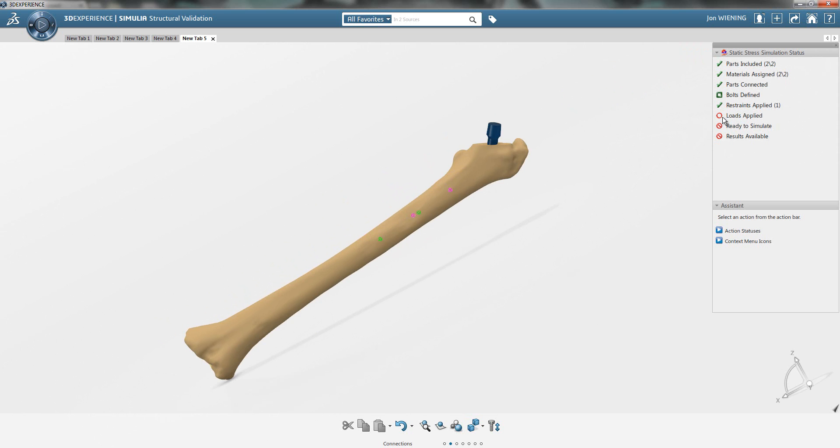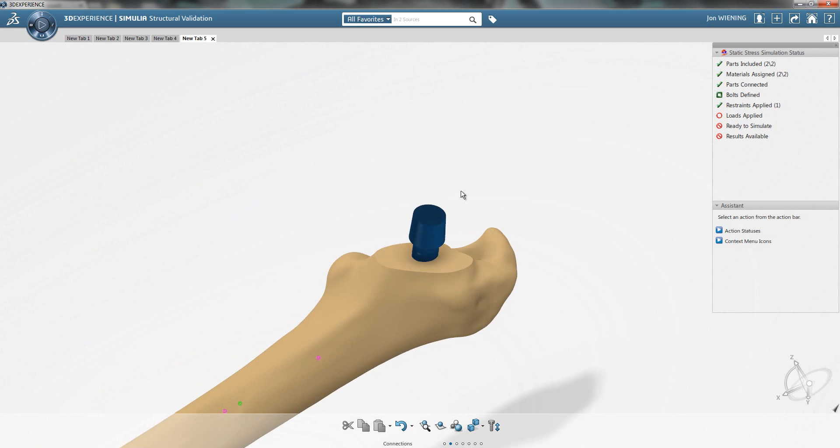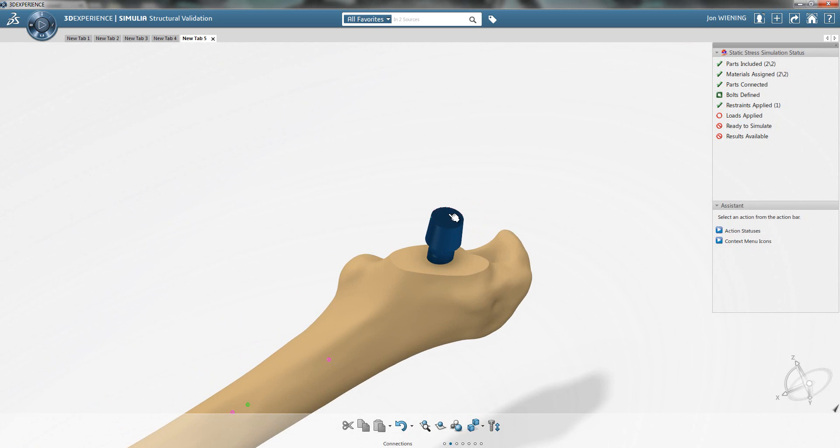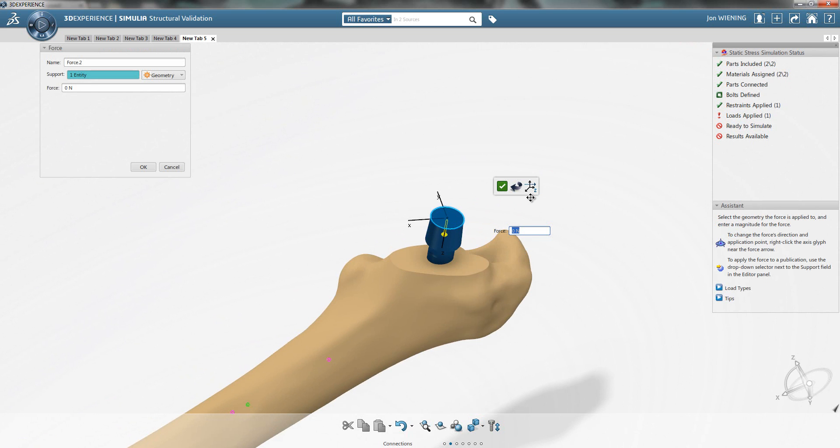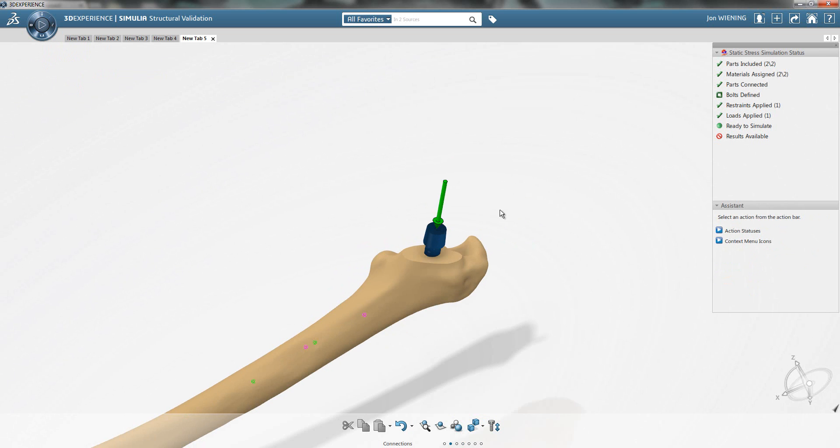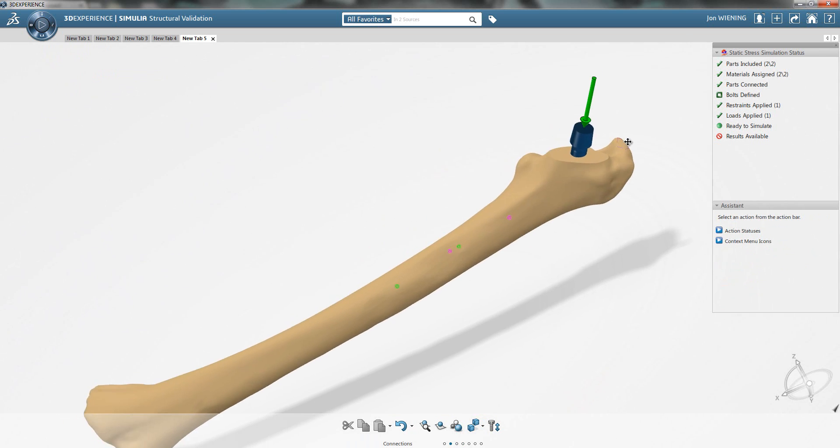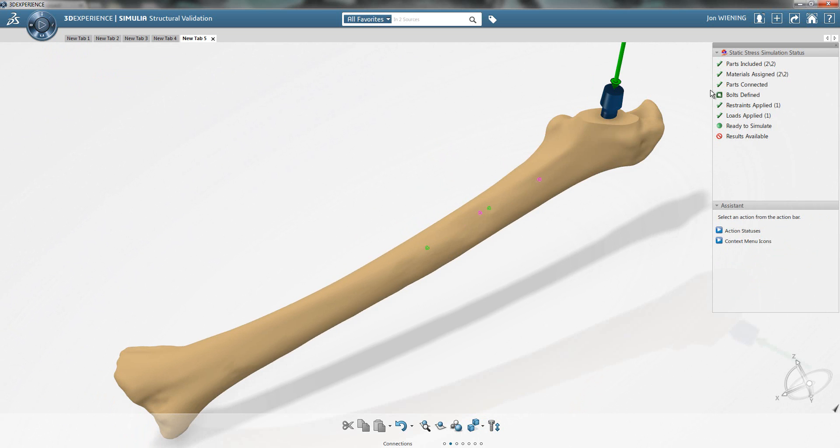Our next step is to apply a load. I'm going to apply a load on this face here, which is the region associated with the implant. We'll define a normal force in this region. You can see now we have our model entirely defined. We have green check marks indicating that everything has been minimally satisfied, all the way down to ready to simulate.